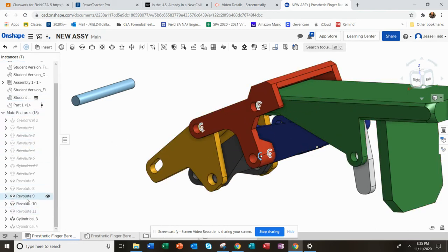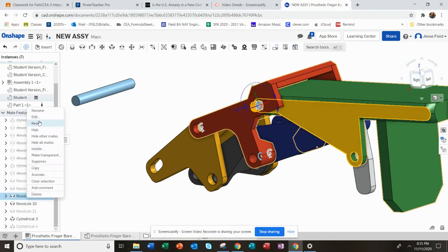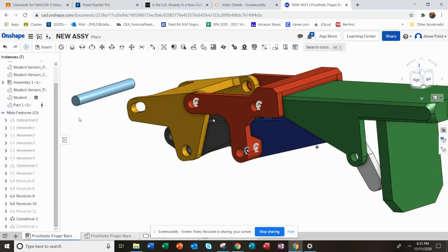I'm going to go — it's that one right there. I can edit it and make the limits of rotation 0 to 90. Let me try that.